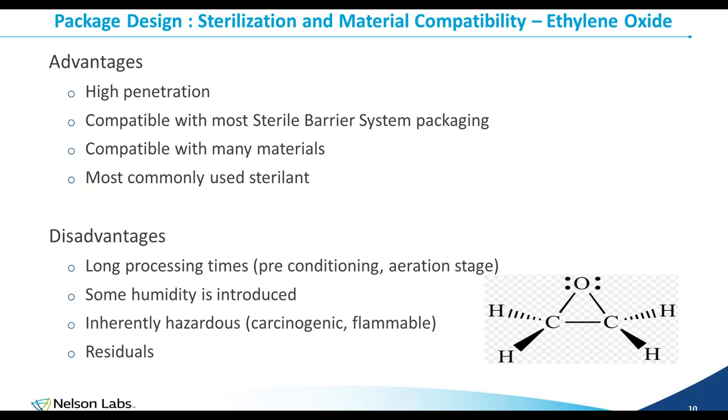The disadvantages are long processing times, because with ethylene oxide, it's gas in, gas out, so not only does it have to penetrate, but after it penetrates, it can linger in the packaging, so you have to allow for the aeration portion of it. It is hazardous, it can be carcinogenic, and it is flammable. And then, like I said, we have to worry about residuals during the aeration stage.